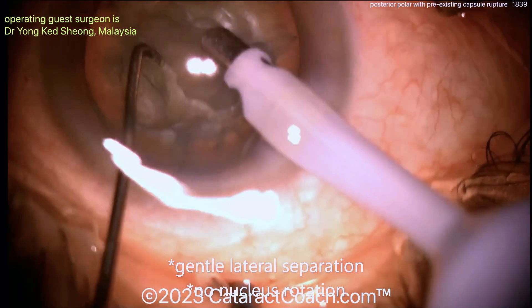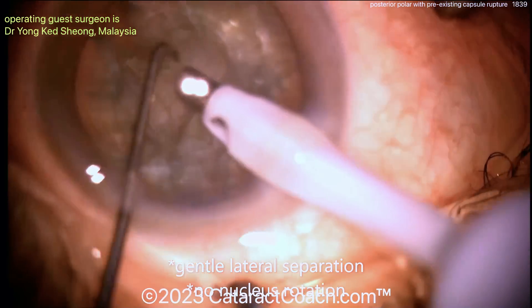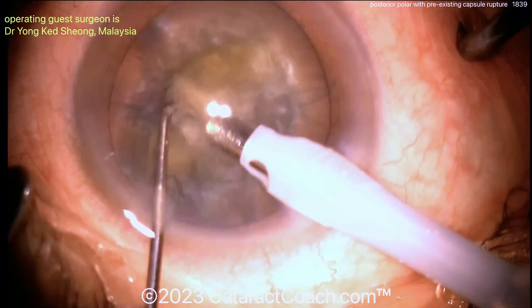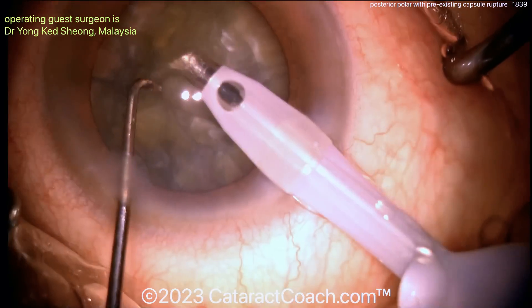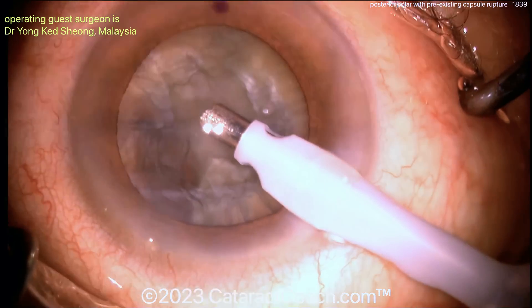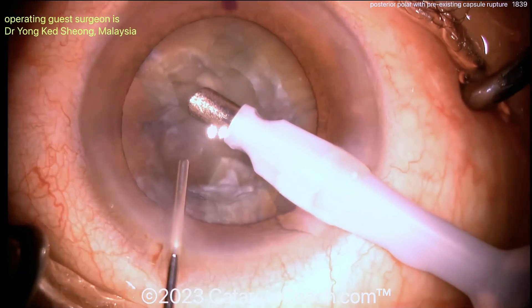Bringing them up — gentle, gentle. You can try to rotate the nucleus but it may be difficult given that there is no hydrodissection, so you don't need to do that. Just split the pieces and bring them up. As we learned from a previous video on Cataract Coach: when you have a damaged posterior capsule, do not do hydrodissection, do not do nucleus rotation. You don't need to — just get the pieces up. Don't let the AC collapse.